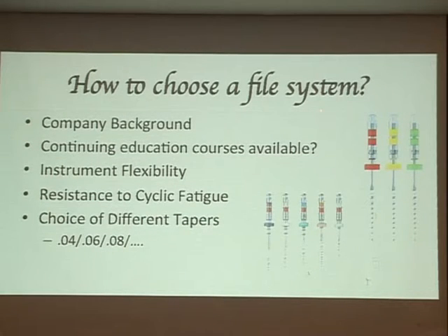It's my recommendation you look for a system. I'm not saying that this is the best, but you need to look at the company background, whether there is any track record, how's the R&D, whether they conduct courses to teach you how to use it. If you like to drive a car, you like to ride a bike, you need to go for training, right? If I give the bike to you and I don't teach you, we won't see you again. Same thing with files, you need to know the strengths and weaknesses of the systems. So you need a good track record. A file that is more flexible and has more cyclic fatigue resistance is the best.